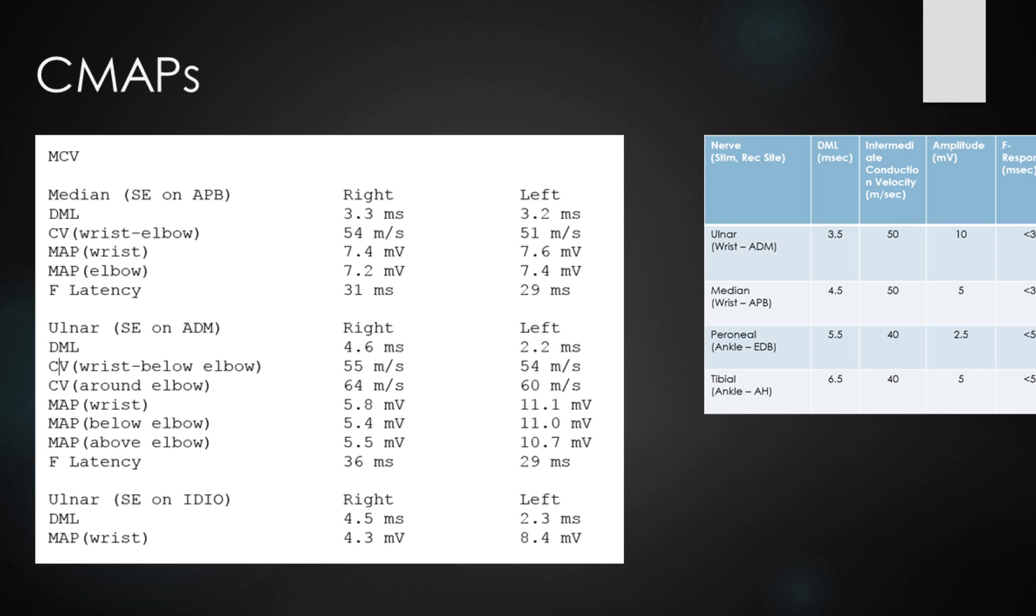Let's have a look at the motor amplitudes now and compare them to the other side. We can see the amplitude is 5.8 millivolts compared to 11.1 on the other side. So very clearly we have a reduction in the motor amplitude response and slowing distally across the wrist at 4.6 milliseconds for the ulnar nerve. Coming to the F latency, this is clearly delayed at 36 milliseconds compared to 29 milliseconds on the left-hand side.